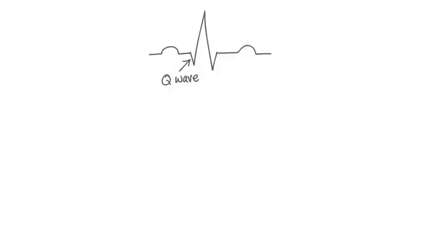Now, some interesting and important QRS complex assessment hints. QRS complexes normally throw the students off. The second thing I look at is the P waves and their association. So let's talk about the QRS complexes first. The QRS complex has a Q wave, which is the first downward deflection. By definition, any downward deflection before the R wave, which is the upward deflection, is the Q wave.